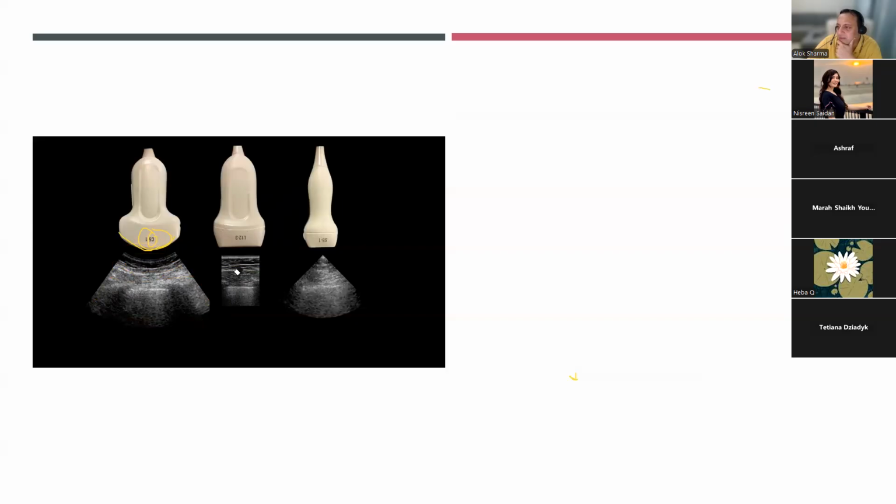When I look at it, the way tissue is delineated superficially over here is much better. But because I'm using a higher frequency, you can also see that I get a lot of dropout here. I'm not getting the deeper tissue appearance that I would normally get over here. So I might want to use something in between. Now, for an extremely preterm baby, a linear probe will suffice, but you might want to use a hockey stick probe, which can give you even higher frequency.